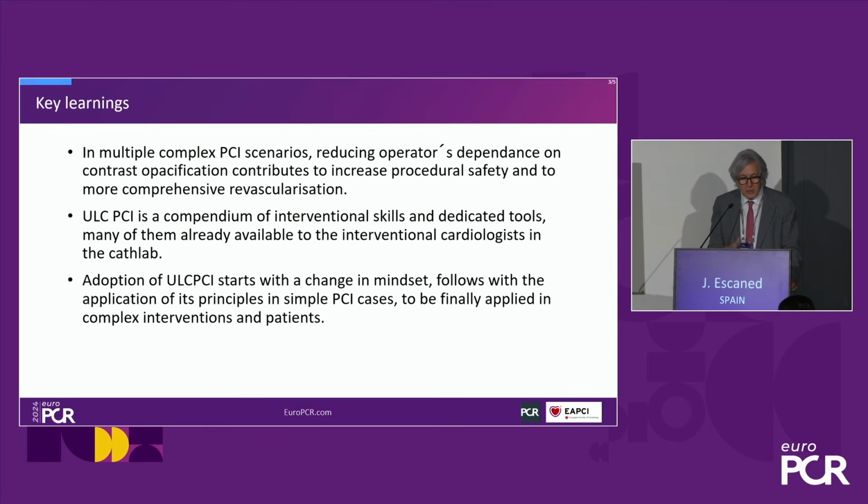Reducing the operator's dependence on contrast opacification contributes to increasing both procedural safety and more comprehensive revascularization. Less is more is a sentence that we take from Dejan from now onwards. I think this is very important. Ultra-low contrast PCI is a compendium of interventional skills and dedicated tools. You can incorporate the Renal Guard, for example, many of them available at the time to the interventional cardiologist in the cath lab.